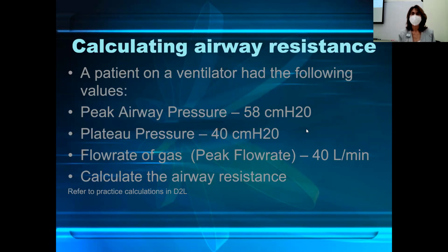Very small airway resistance. Then we put somebody on a ventilator and stick in an endotracheal tube. They've probably got some other things going on, so they have higher airway resistance, between 6 and 10 centimeters of water per liter per second. Those are the normals.